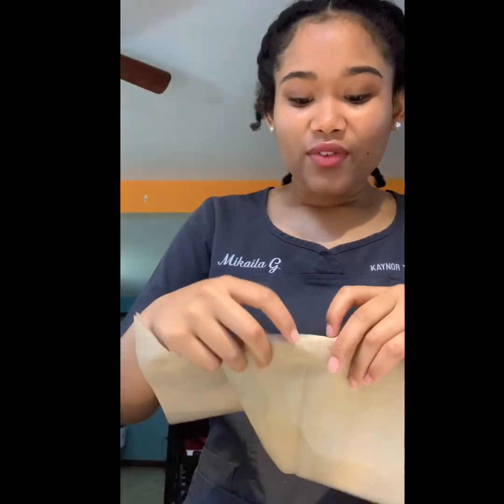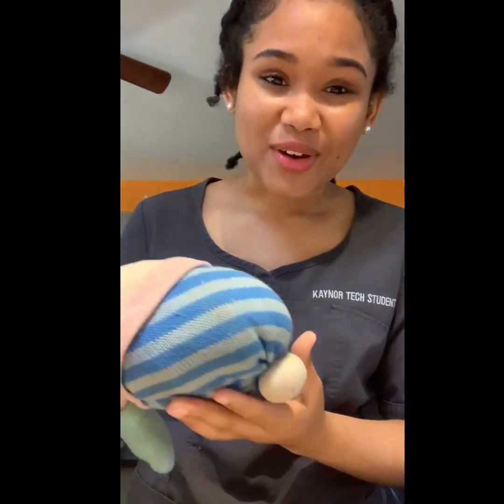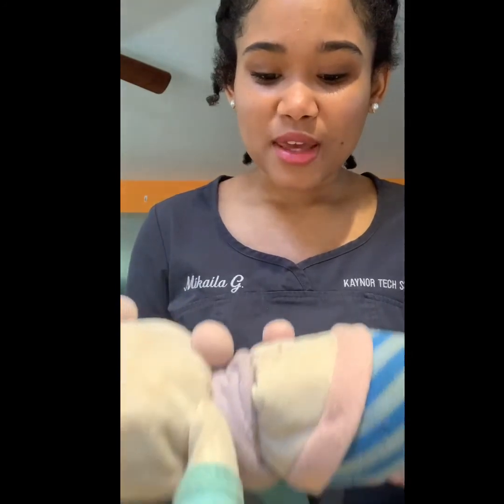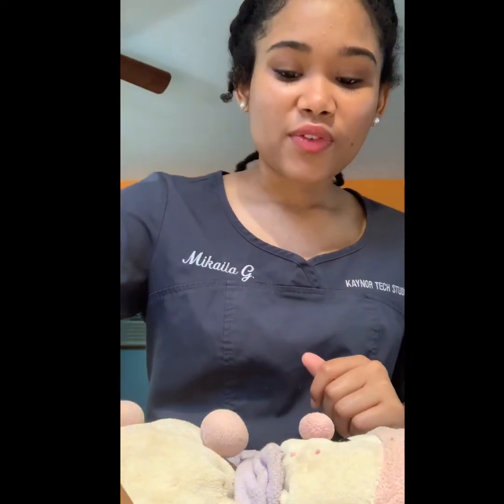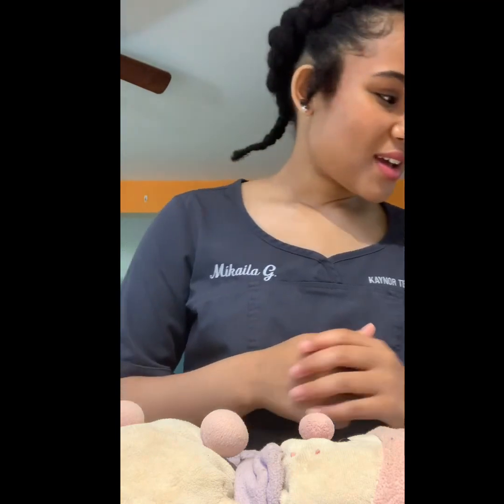So first, to measure the weight, I would place a proper cloth, not a napkin necessarily, but that's in the right circumstances, on the baby scale. And then I would place the baby on the scale. I'd wait a few seconds until the measurement shows up on the scale, which should be in grams for accuracy, and then I would convert it to pounds and ounces for the parents.